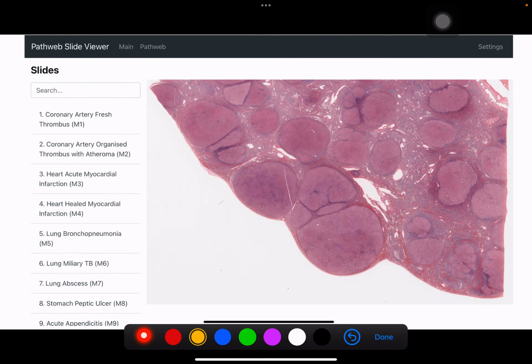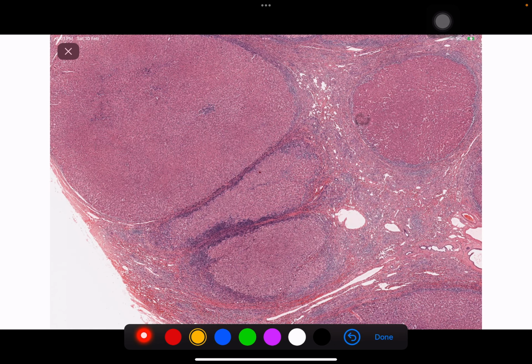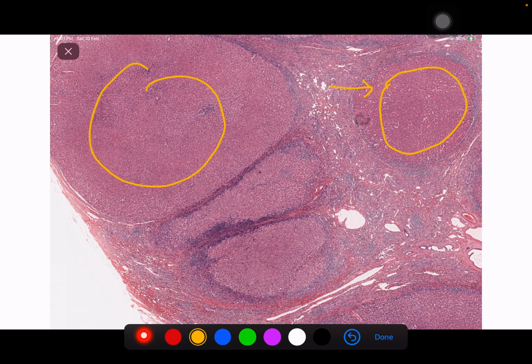In cirrhosis, when you open the image, you will be given this virtual microscope. From here itself, you can see the abnormal architecture of the liver, because this liver becomes nodular. As what you see grossly, it appears like nodules. It also appears microscopically as nodules. These are called regenerating nodules, because they are composed of proliferation of hepatocytes. All these are proliferation of hepatocytes.